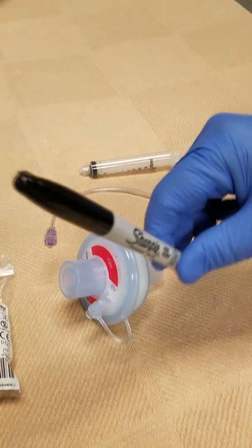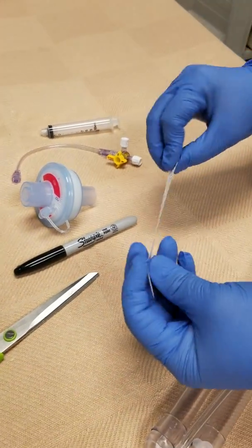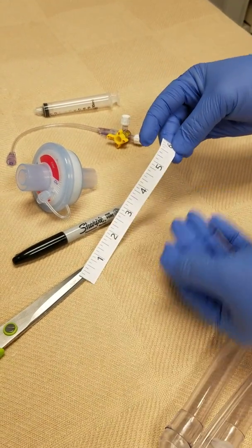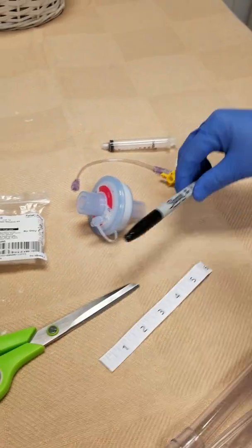You also need a marker, a scissor, and we use a pre-measured six-inch measuring tape to measure on our circuit so that way we can cut. Before we do all of that, let's prep everything first.